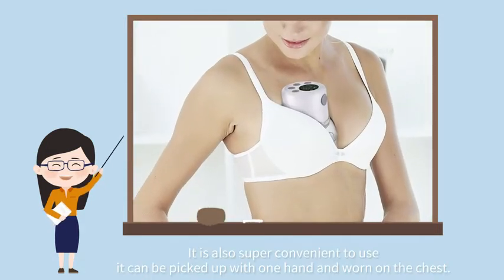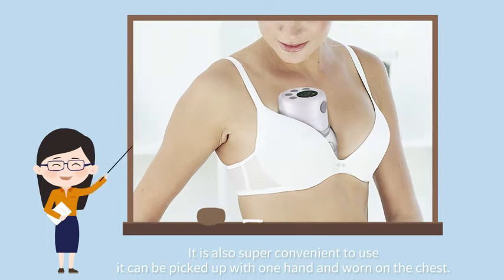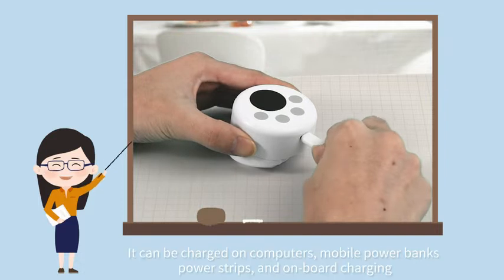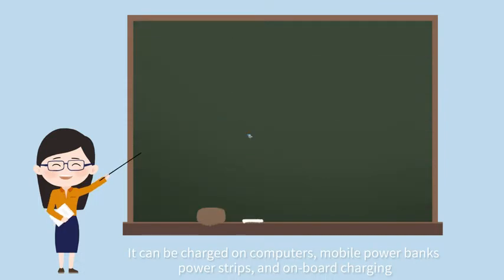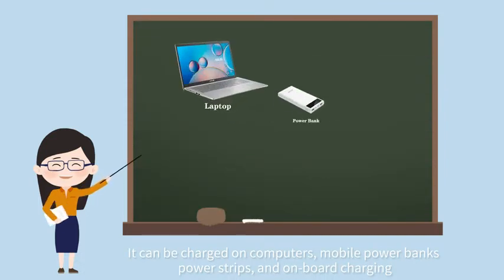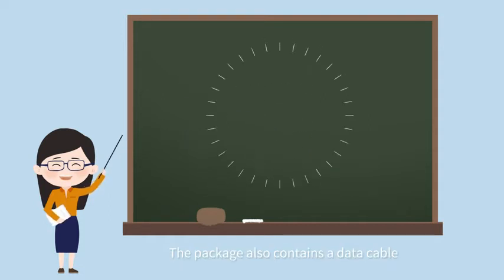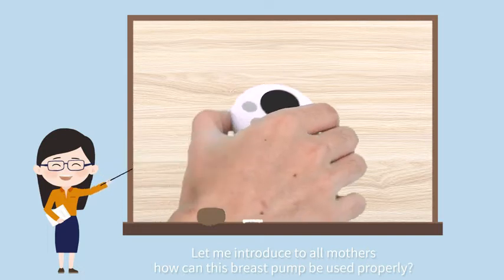It is also super convenient to use. It can be picked up with one hand and placed on the chest. Charging is also very convenient — it can be charged on computers, mobile power banks, power strips, and via on-board charging. The package also contains a data cable. Really caring.